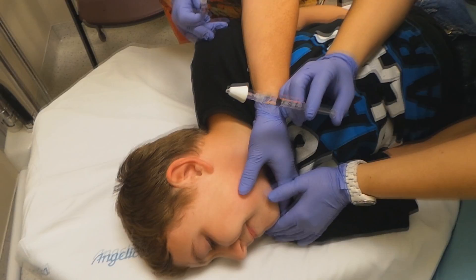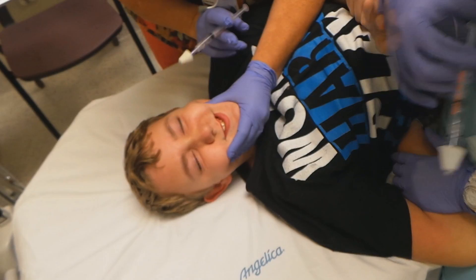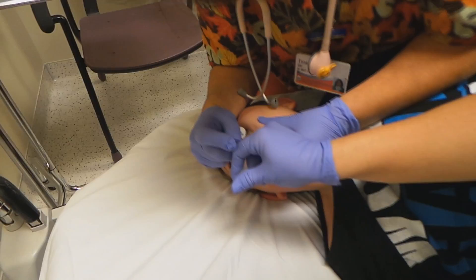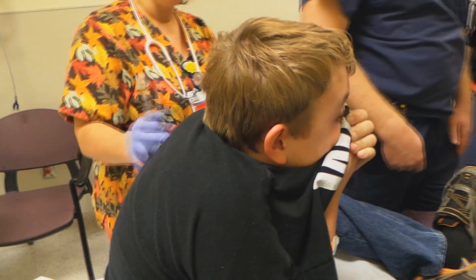Here we go. Hold still, Thomas. You've got to hold real still, Thomas. Okay Thomas, you ready? Don't be anxious — I'm going to count it out. It'll be okay. It's just in the nose. One, two, three, go. All done. All right. Sniff it up there. Don't blow it out. You relax. Good job. Don't blow it out.